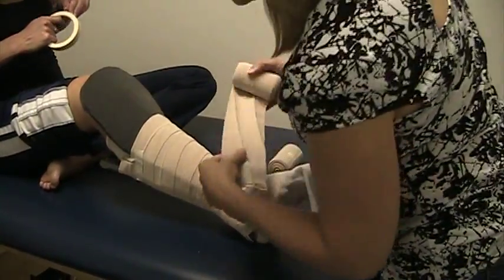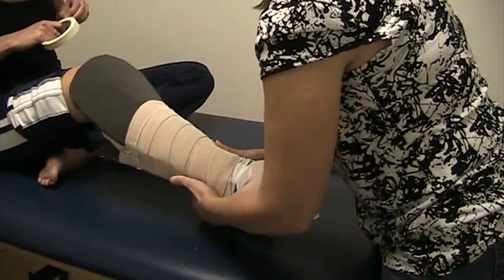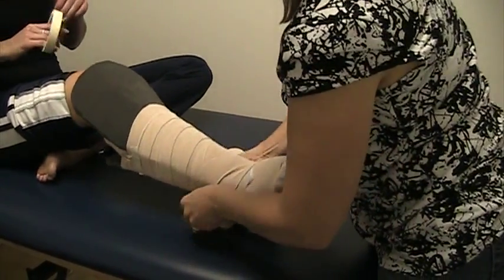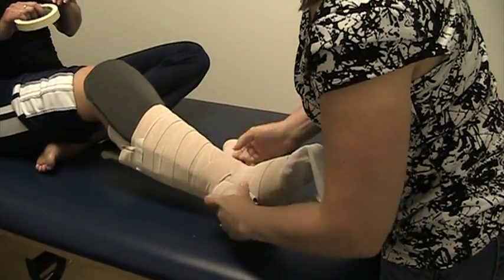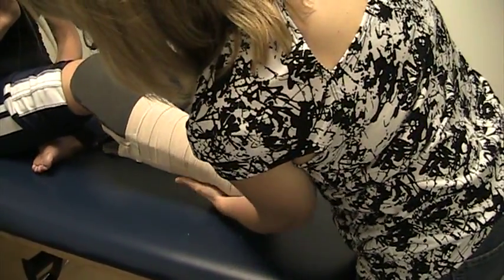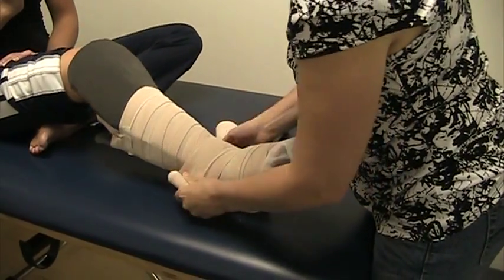The next layer is applied in the opposite direction of the first bandage. This is an eight-centimeter bandage. Starting with the anchor at the ankle, coming down applied to the heel, rolled back up to the ankle, and down to the sole of the foot. No extra stretch is applied. You repeat that pattern — heel, ankle — and you can contour the ankle a little bit by pushing in and around the Achilles tendon, back down to the sole. You can repeat that three times, depending on the needs of your patient.